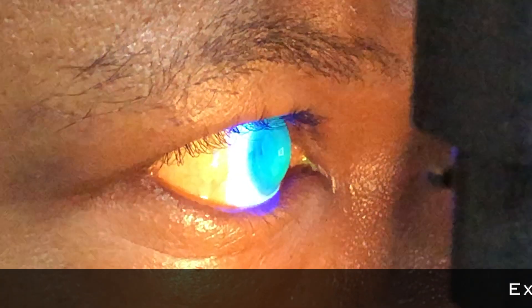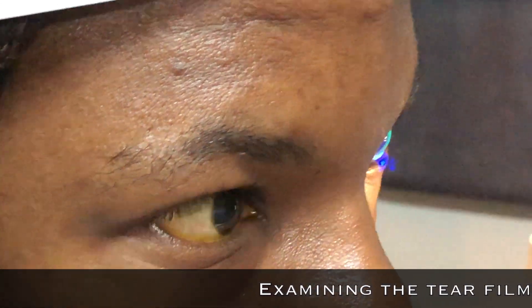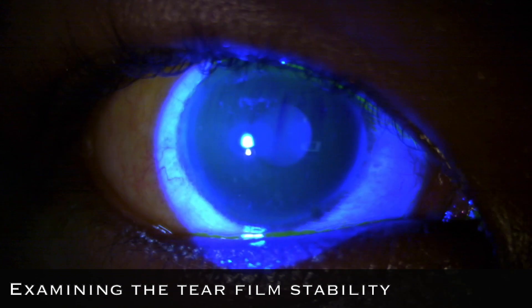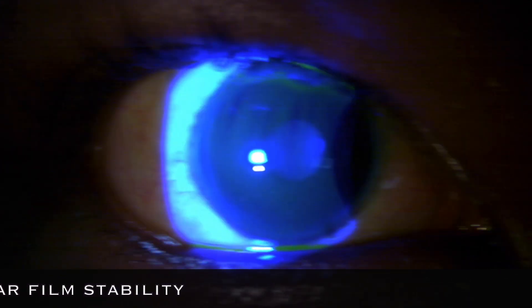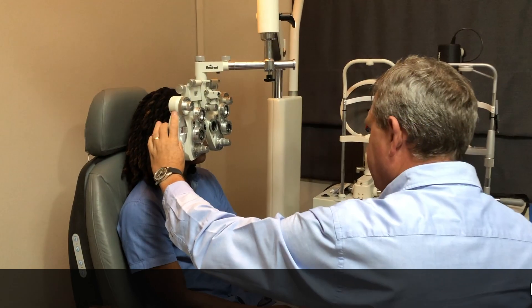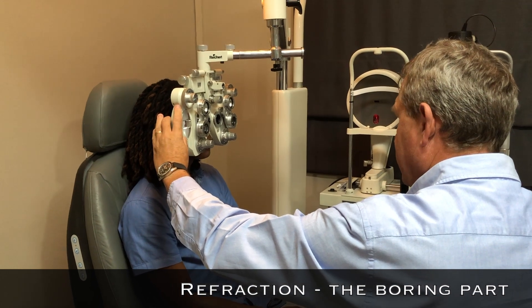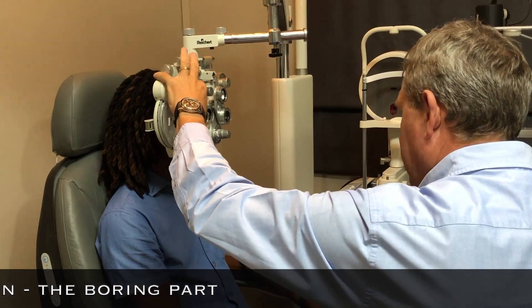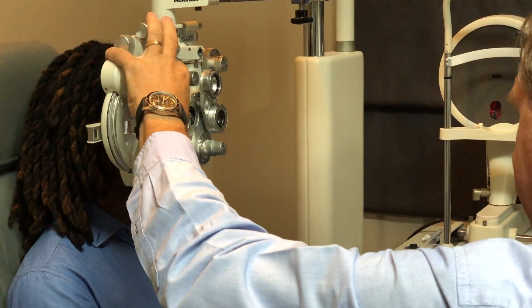There's a little bit of dryness, so we see that. Let's look at the other side — blink your eye again and again. Better there or better here? It's almost the same. Let's check if I make some difference now. One. Two.